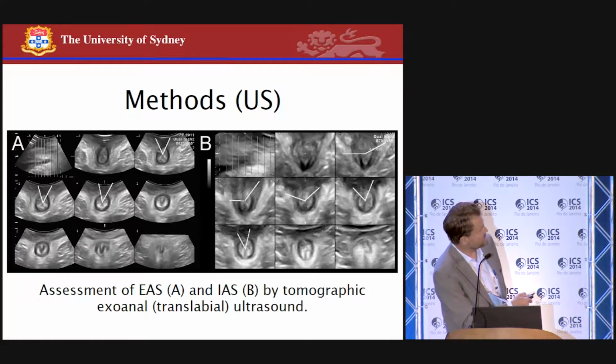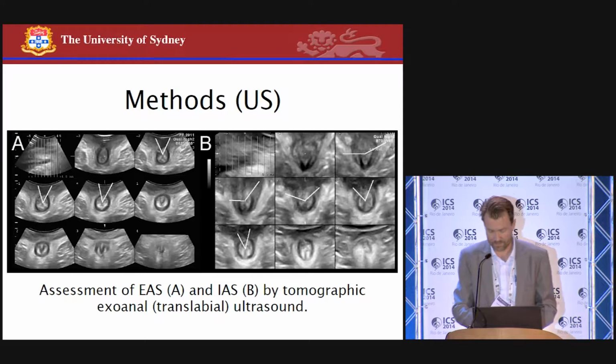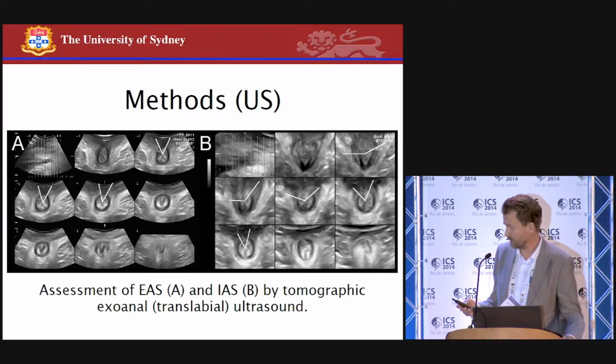In this case, this lady has much more severe trauma. The external sphincter is virtually completely destroyed, so that donut shape has changed into a U shape. And in this case, I'm illustrating a defect of the internal sphincter, which is really small here, a bit larger here, reaching the cutoff of 30 degrees or 1 hour, and much larger here. And over here, the internal sphincter is completely open. It's not even a U. It's more like a shallow boat.